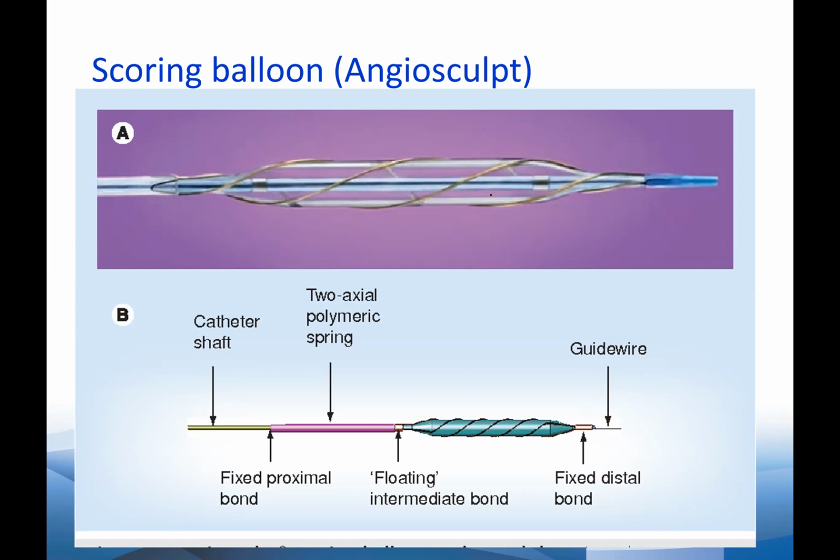And you want to have a dissection so that you can put a stent in there, so that the stent can expand. So we use this kind of balloon when there's focal calcium, or if the balloon is slipping, what we call melon seeding. You might have heard this term, melon seeding. The balloon might slip forward, backward, or just because of the toughness or calcium in the plaque, or maybe the patient is breathing, it will stay wherever it is, and it can get stuck there.